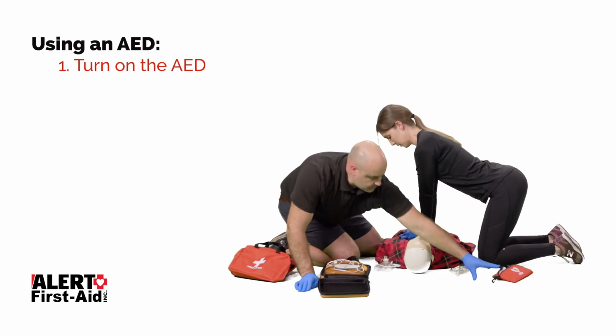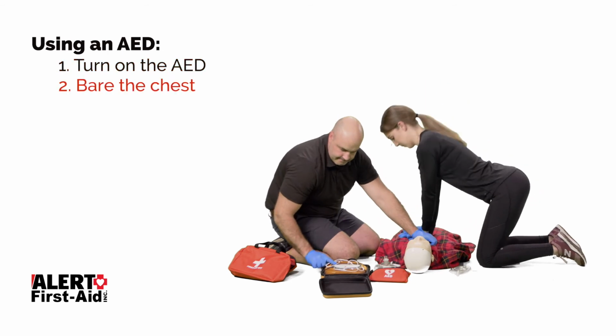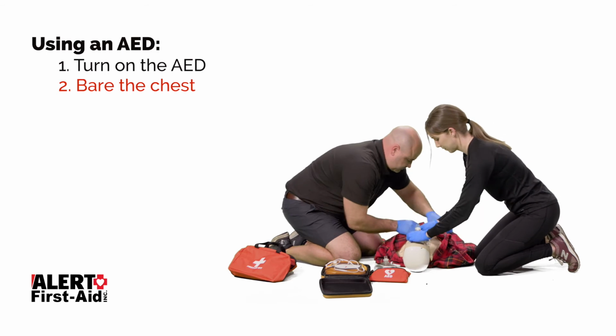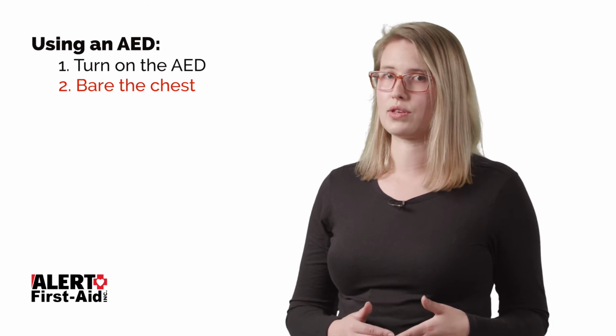First thing we want to do is to turn on the AED and listen to the instructions. You will need to bare their chest. Scissors will be packaged with the AED in order to make this easier. Cut clothing if that'll save time. Try your best to work around the person who's doing CPR while you set up the AED. Their chest should be completely bare, including bras and medical patches.